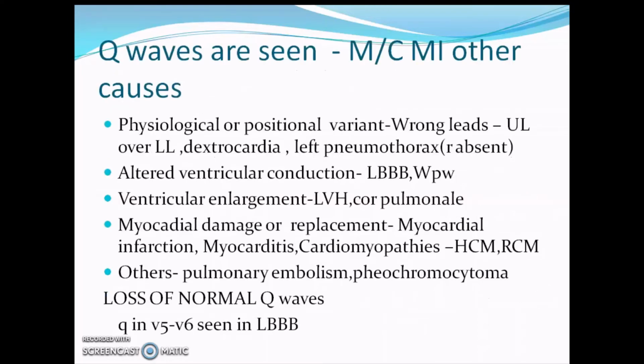So what are the causes of Q waves? The most common cause of Q waves is myocardial infarction, but you need to know the other causes also.